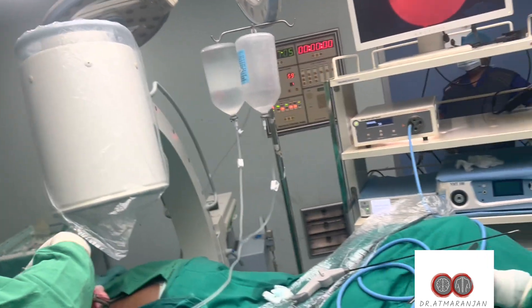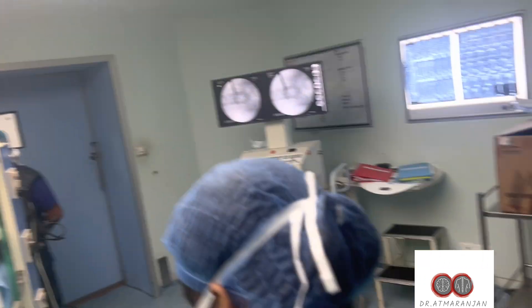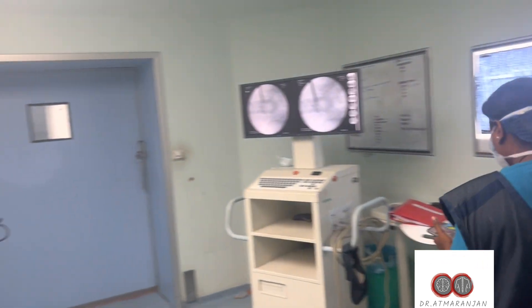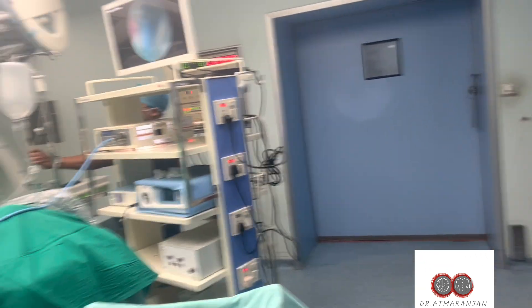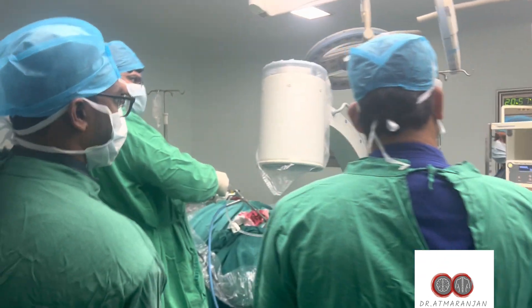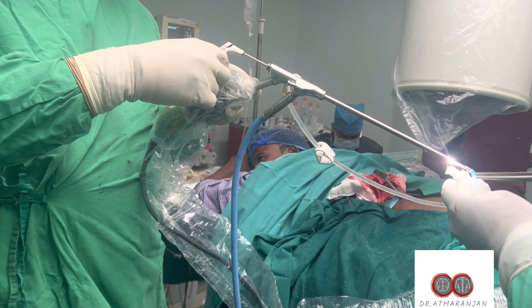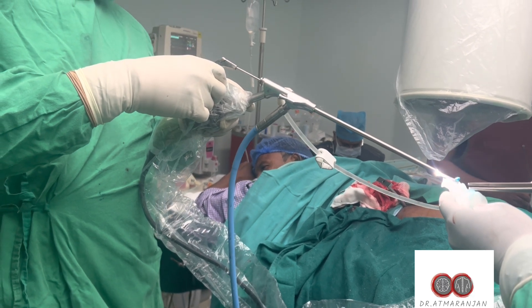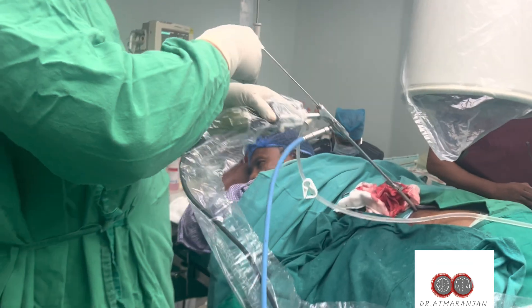This is a unique procedure where we use radiofrequency waves — we can also use laser for the same purpose. Because the patient is awake, we can prevent neurological deficits while operating, as the patient will be moving their limbs throughout the surgery. We can see the degenerated disc parts being removed.